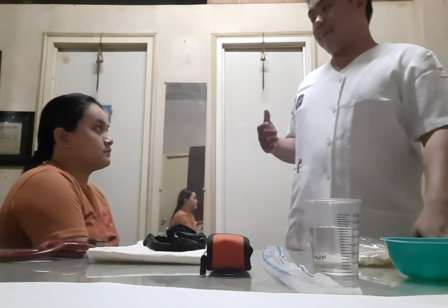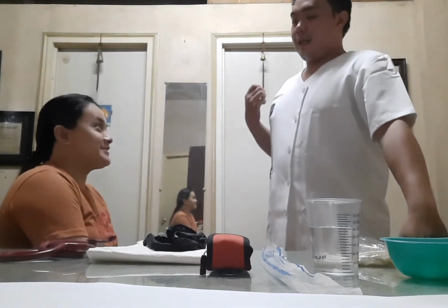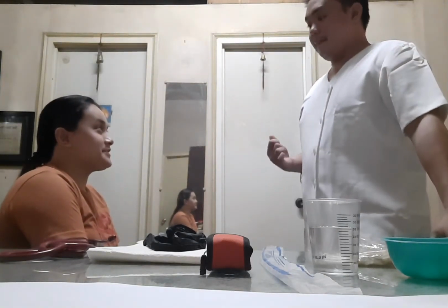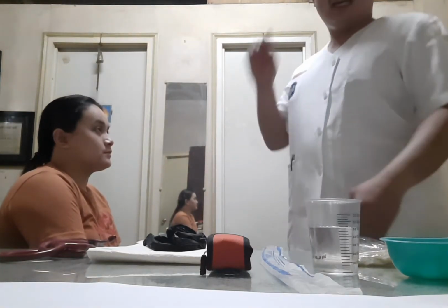Okay, assuming that I will verify my patient. Are you Pamela? What is your name, ma'am? Pamela Reyes. And you are the patient that needs to be suctioned? Yes, as per the doctor's order. So after verifying the patient's name and verifying the patient's need, that is the physician's order, which is the suction, I will be washing my hands.